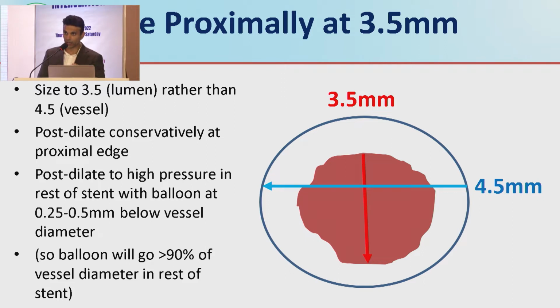And then confirm that when you do the IVUS again, right? We do one pre and one post. The beauty of this approach is on your single IVUS, you get everything, all of the information you need, right?